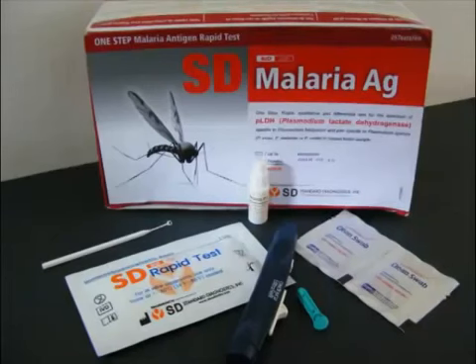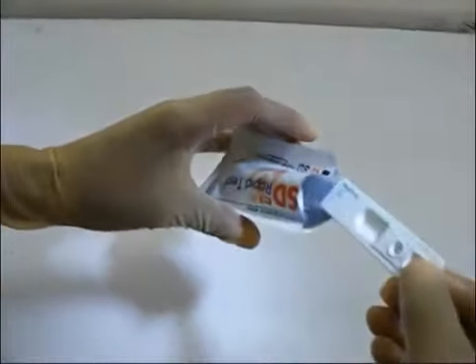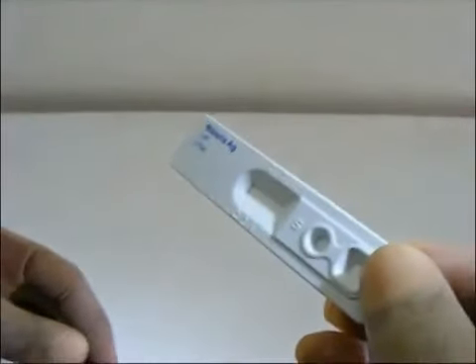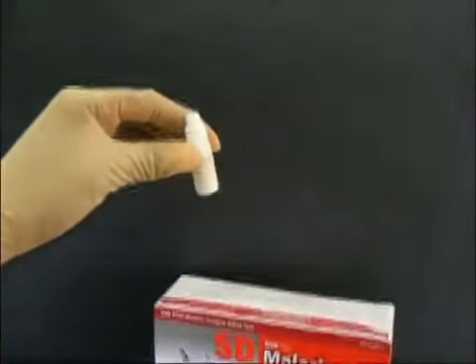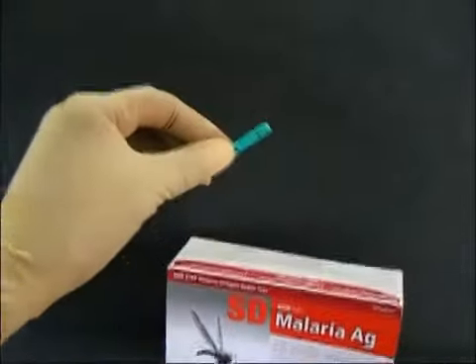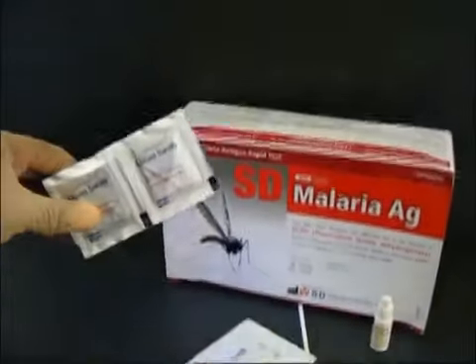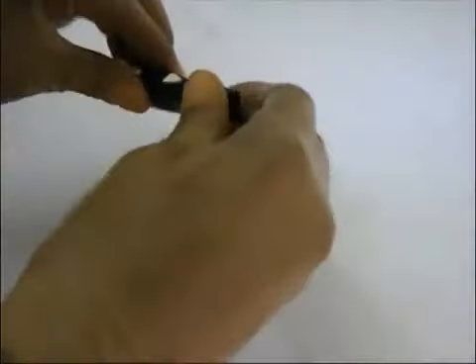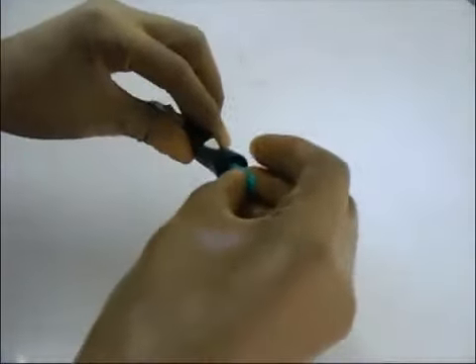The one-step malaria antigen rapid test kit consists of a test device, assay diluent, disposable sample applicator, a lancet, and an alcohol swab. The lancet is fixed onto the lancet holder and made ready for use.